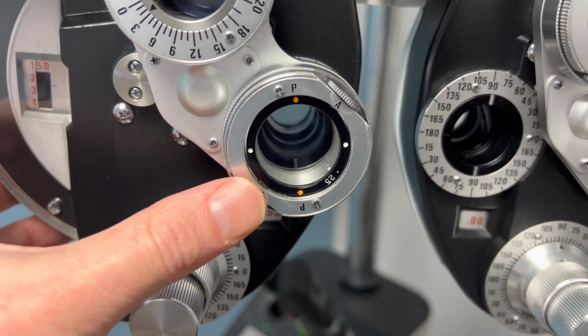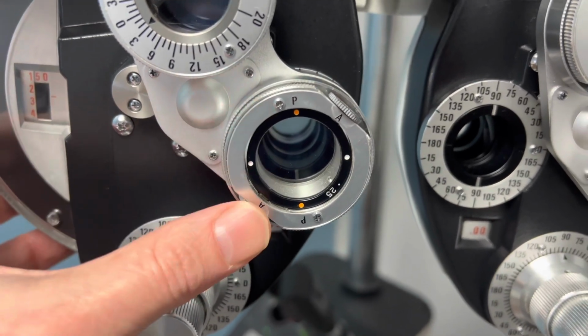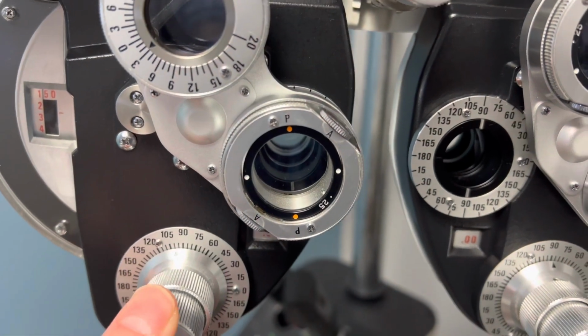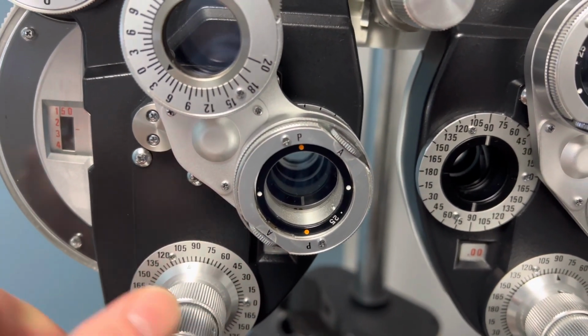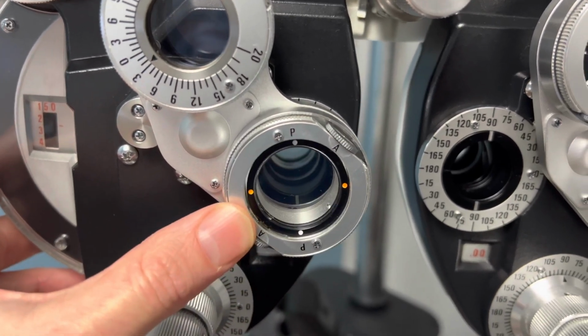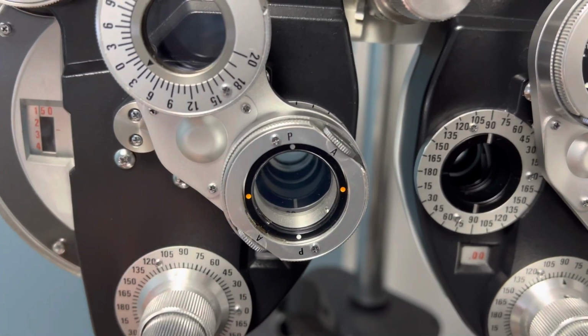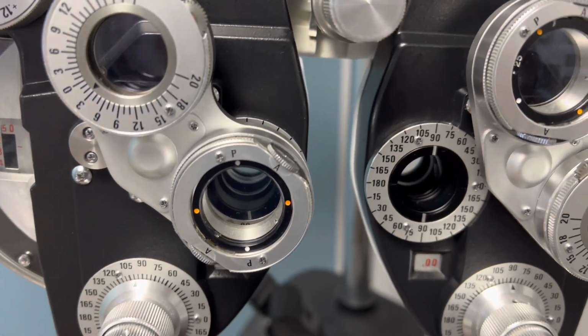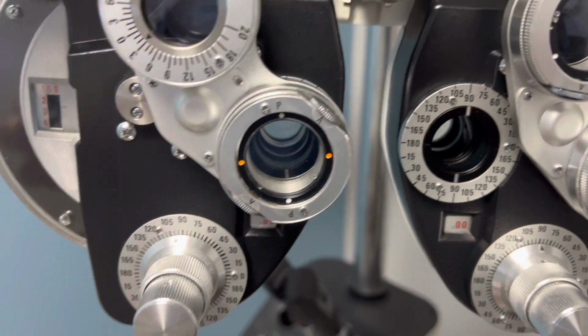If you pick 2, the red lens here, the red dots, it means that you want extra power. So we'll give you an extra click of power here. And then if I say which is better, 1 or 3, you pick white, it means you want less power. So that means you could pretty much go either way on that.